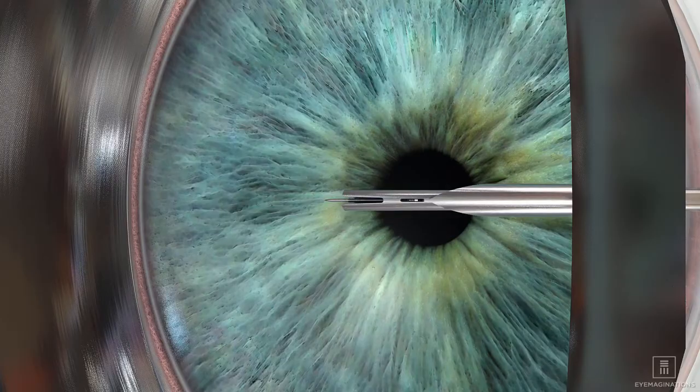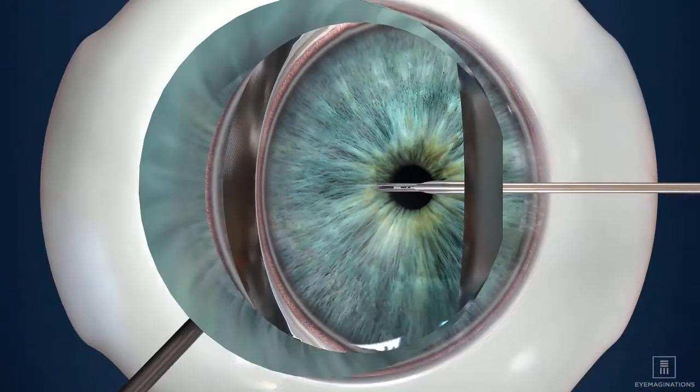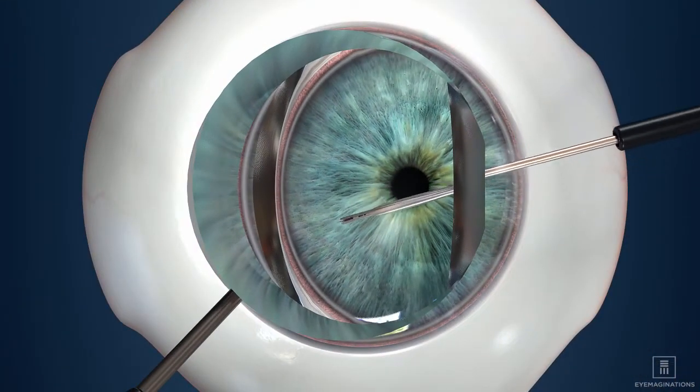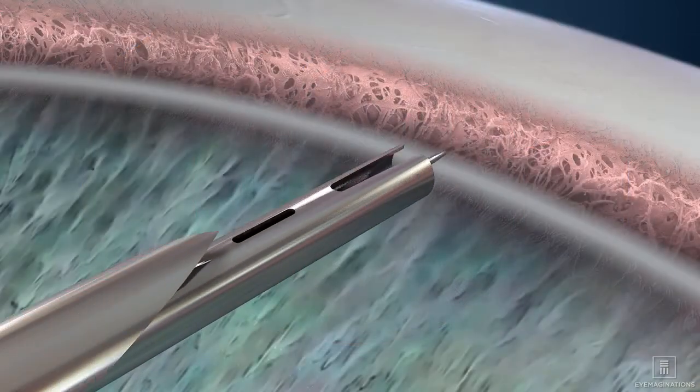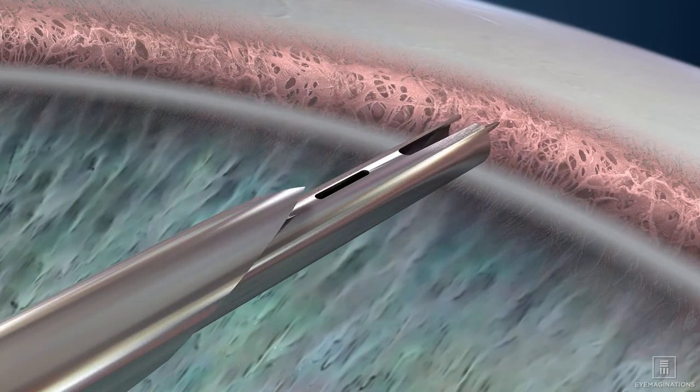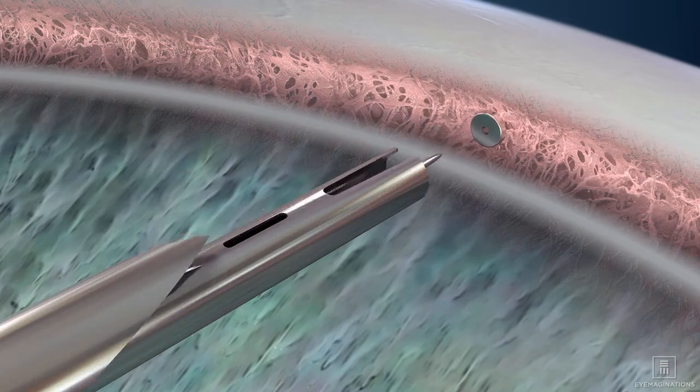A protective covering on the handpiece is retracted and the first Eye Stent Inject is placed into the meshwork of your eye, creating a tiny channel to allow fluid to drain from your eye.